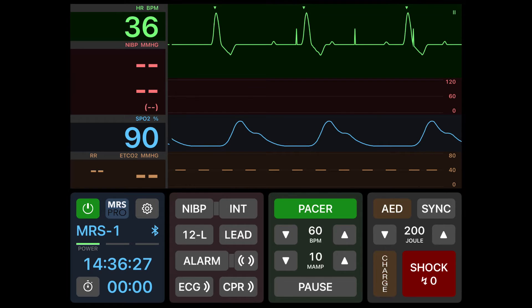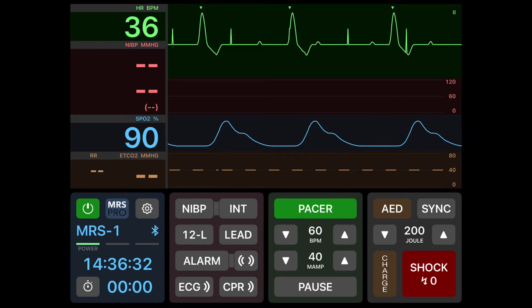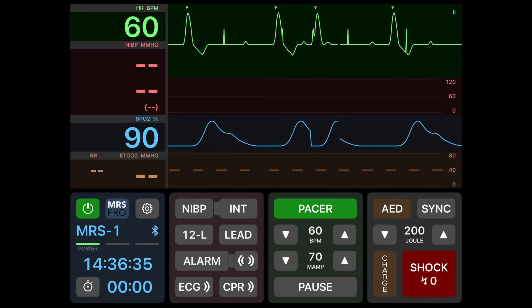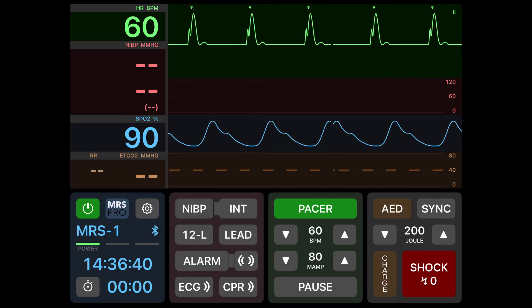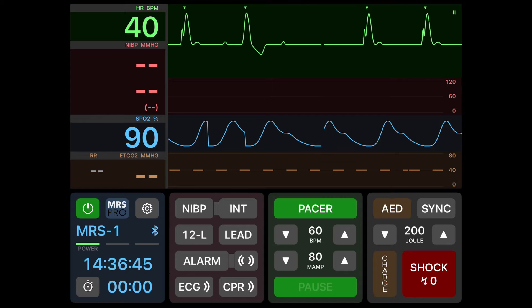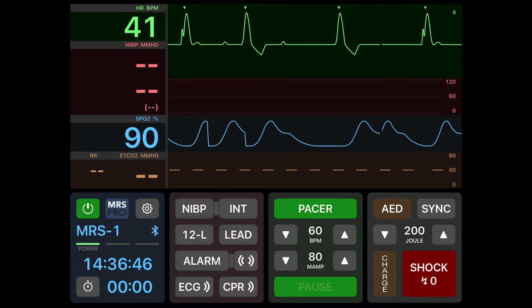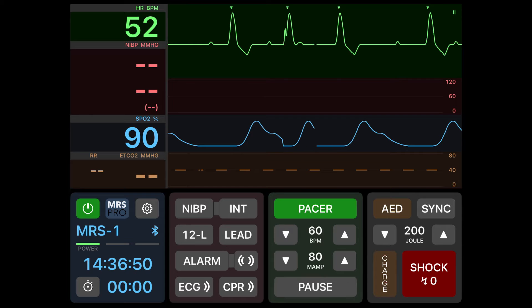Once milliamps is increased you'll see a pacer spike added. You're going to increase the milliamps until you see a one-to-one capture on the screen. If for any reason the student needs to see the underlying rhythm, the pause button can be used like the four-to-one button on the Zoll.